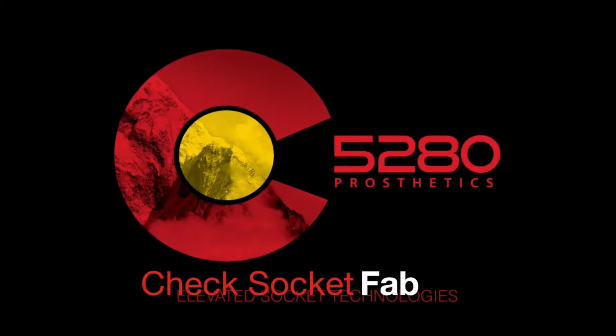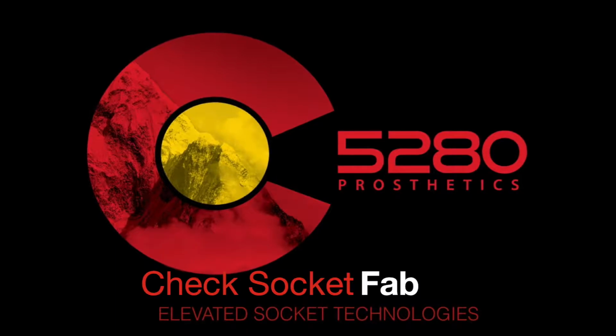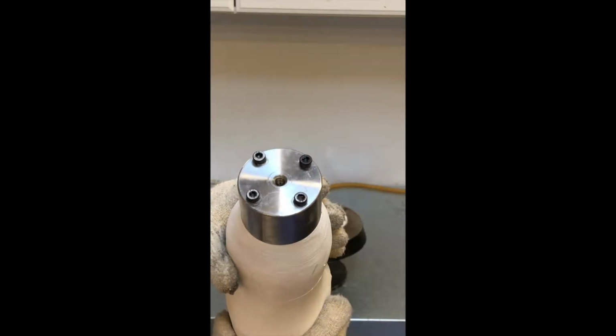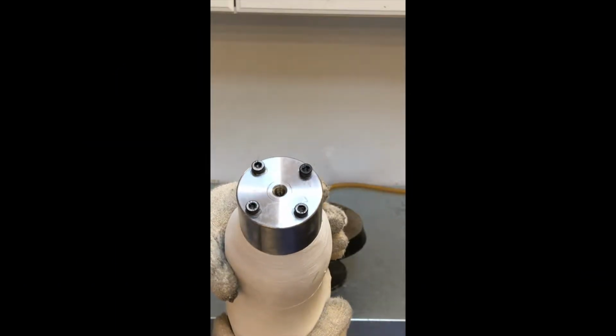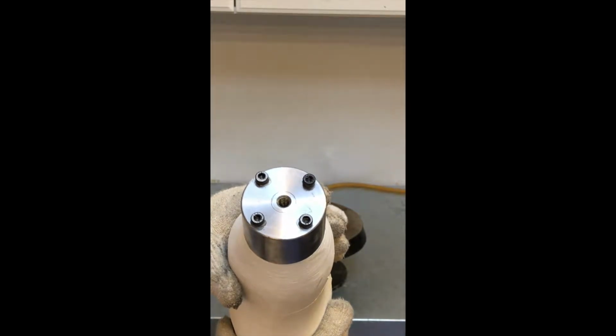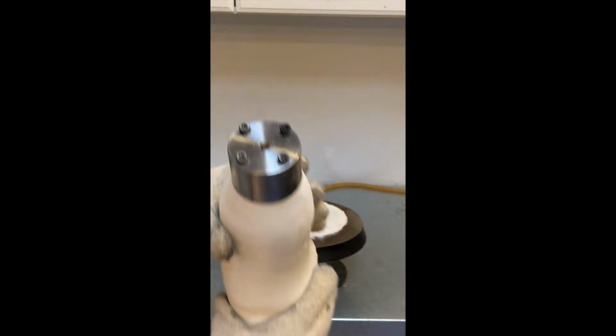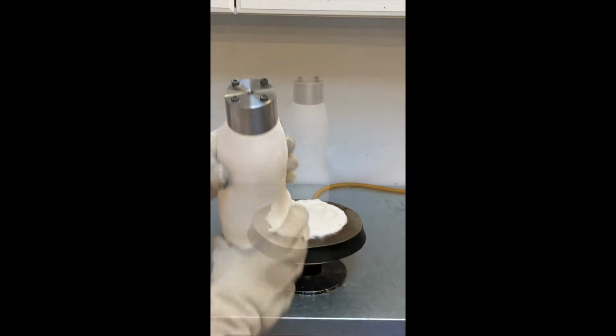This is the 5280 check socket fabrication video for all distal mount pucks. Install 4 cap screws into the distal aspect of the molding dummy. The cap screws can be adjusted in height to vary the distal socket thickness. Be sure you have an air hole through the model leading up to the molding dummy.